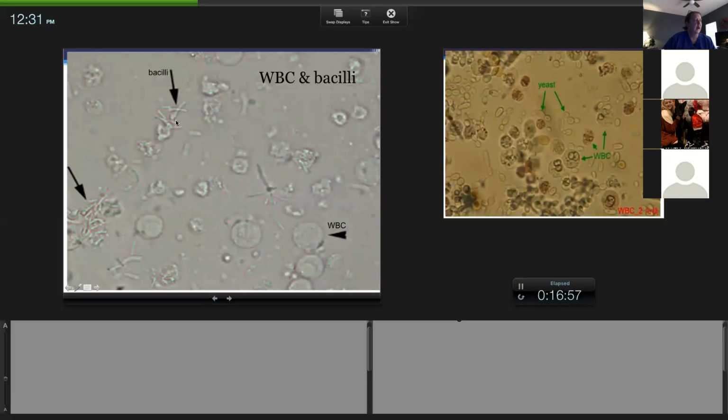And then you've got bacilli, which are your rods. So a bacilli is a rod, and then the cocci would be the circle. Now, a little tip: a lot of dogs, because there can be fecal contamination, sometimes you're going to see rods or bacilli more in a urine, and that can indicate potentially a gram negative or a more serious infection.